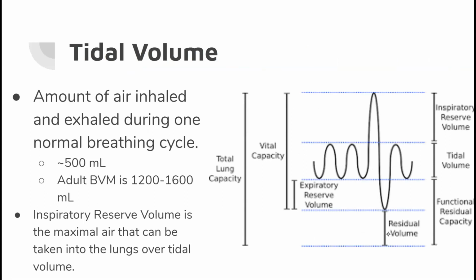We commonly inhale about 500 milliliters of air. About 30% of that lives within dead space and never sees an alveolus. But mind you, the adult BVM, depending on your manufacturer, is anywhere from 1,200 to 1,600 milliliters of air. You don't need to go crazy, just enough for chest rise, right? Back to EMT school there.